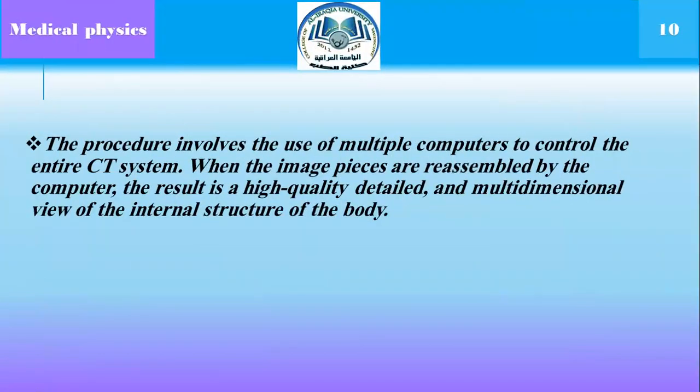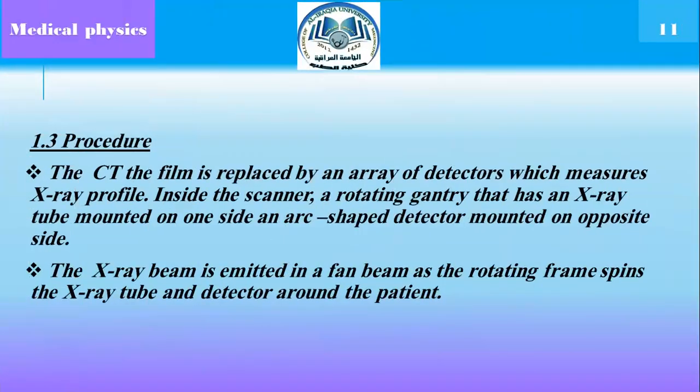The procedure involves the use of multiple computers to control the entire CT scan system. When the image pieces are reassembled by the computer, the result is a high quality, detailed, and multi-dimensional view of the internal structure of the body. Now we explain the procedure.